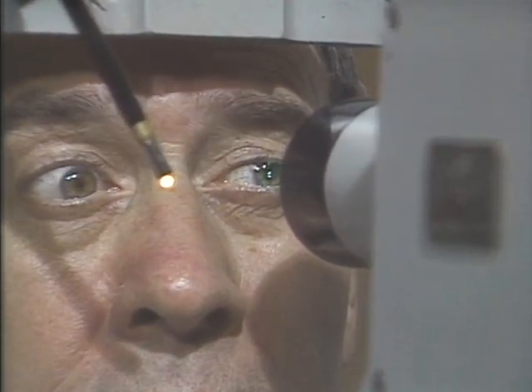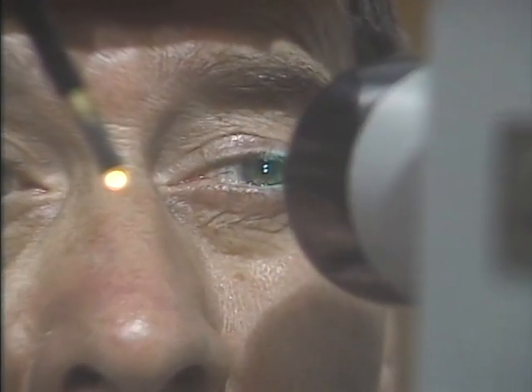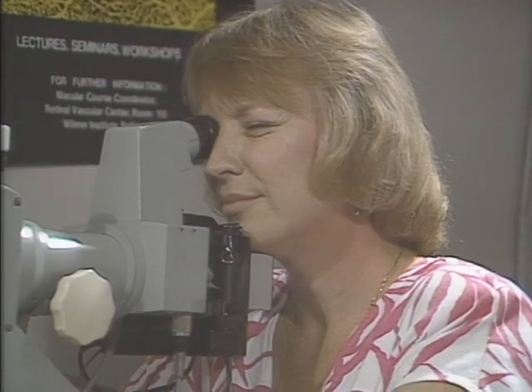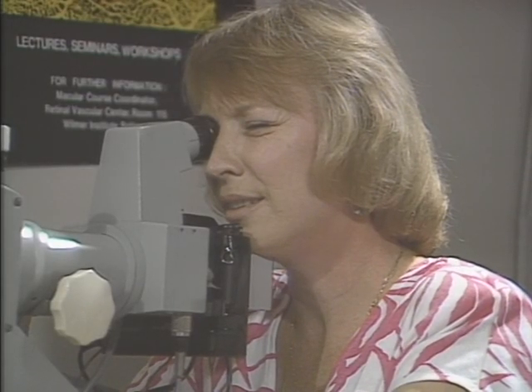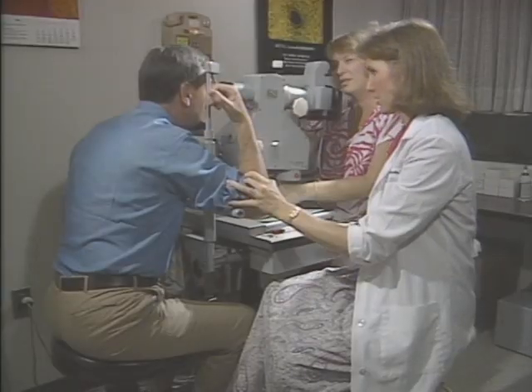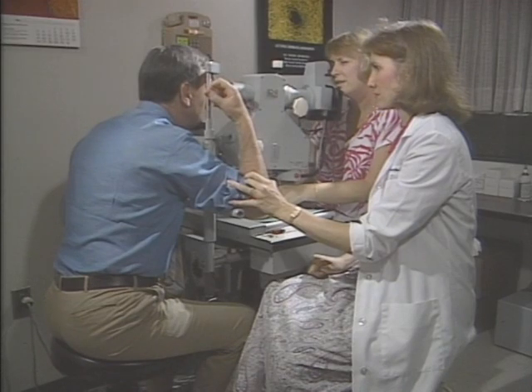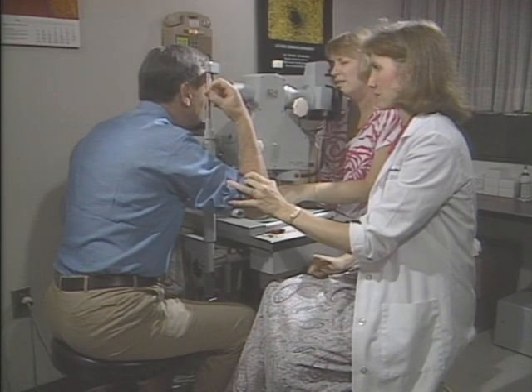The exam usually takes no more than 20 minutes. However, it will take 24 to 48 hours before the fluorescein dye is discharged from your system. Until then, your skin and urine may take on a yellow-orange color.